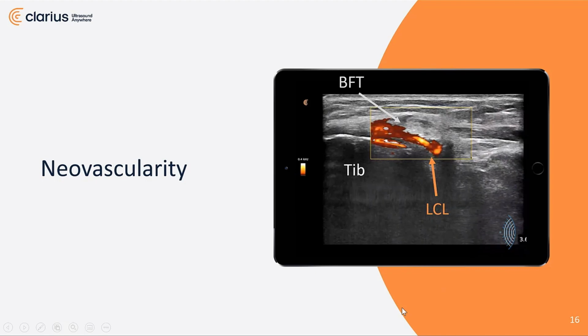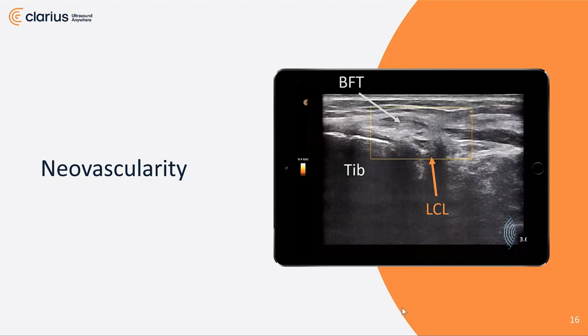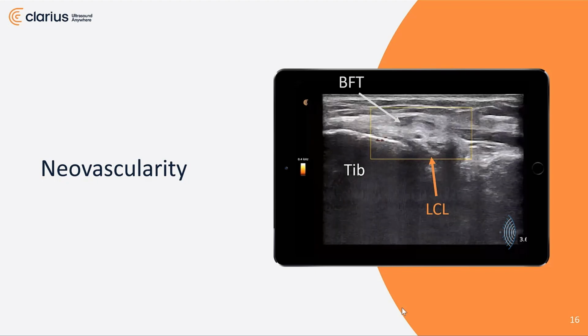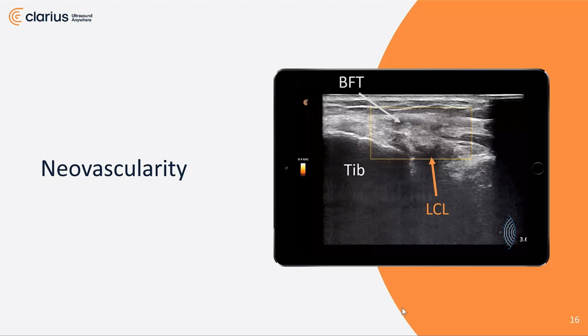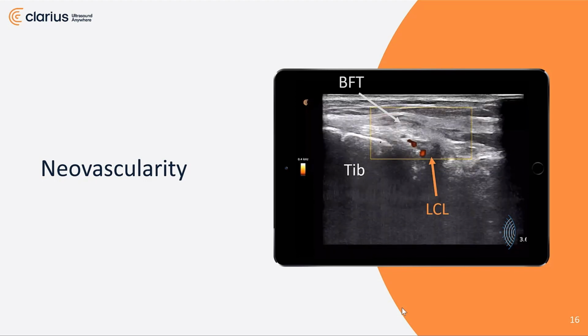And you'll see as I turn on the video, there is excess blood flow between those two structures. Not just excess blood flow, there is blood flow, and that is an inflammatory event. So we have the ability so far to show you that there is a lesion. It's in the distal component of the lateral collateral ligament, and it's in a process of inflammatory correction for healing.